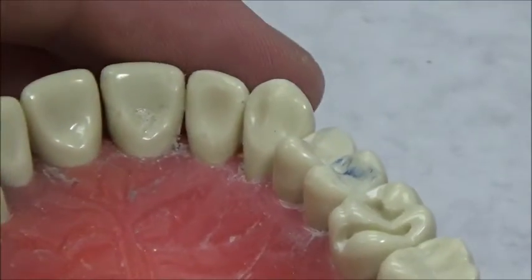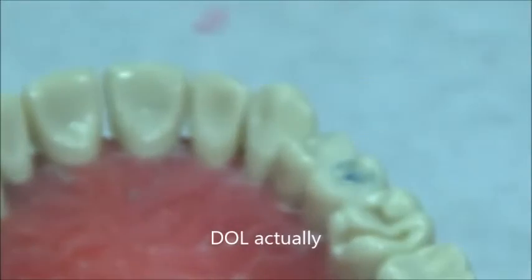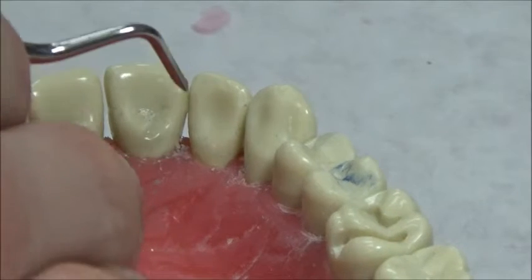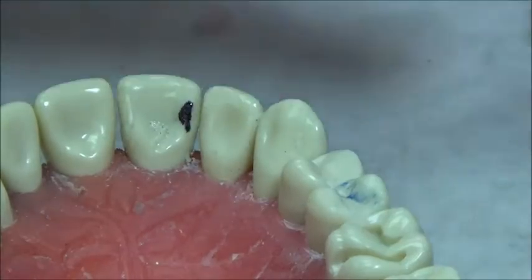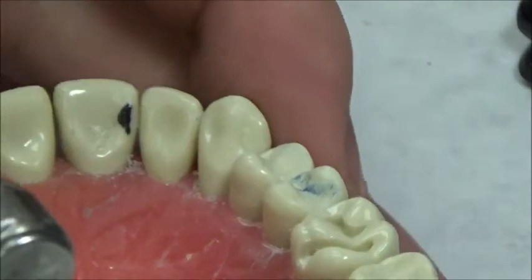We'll be doing a DL on number 9. The first thing — and remember this is straight from the book — the incisal-gingival dimension is 2 millimeters, the facial-lingual depth is 1.5 millimeters, and the axial depth is 0.2 millimeters into dentin. You want to go just apical or gingival to the contact, because that's where most of these lesions start out.